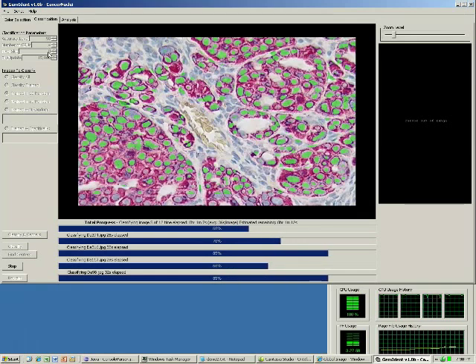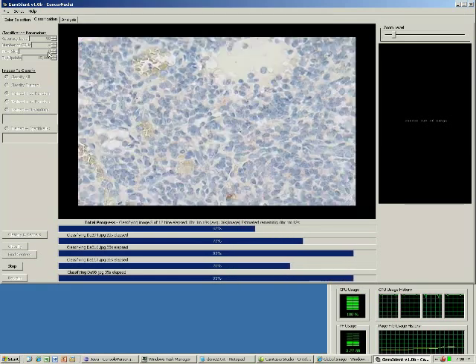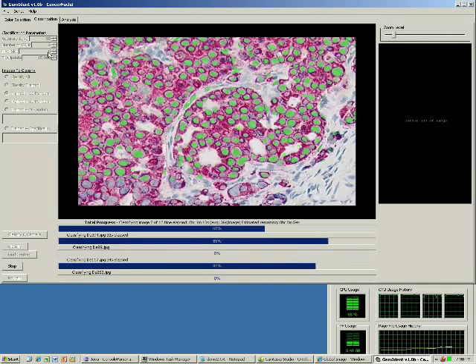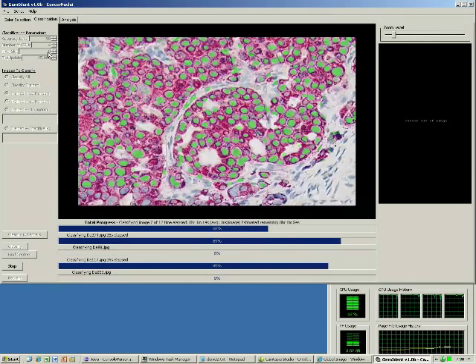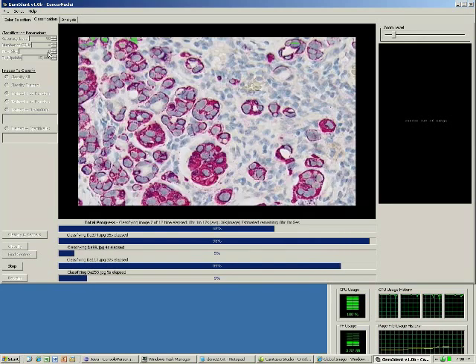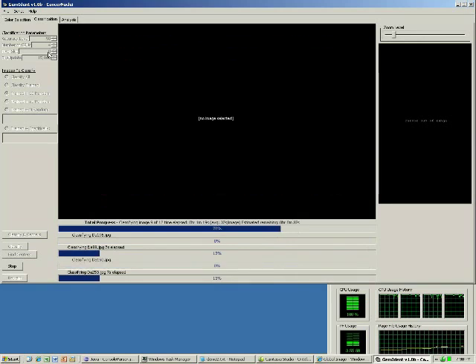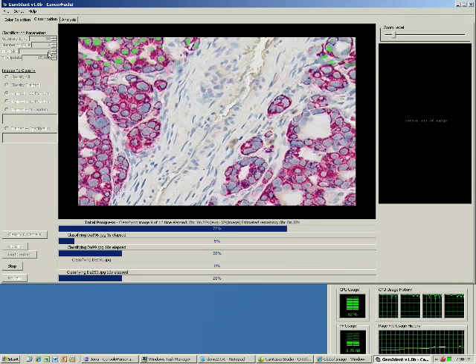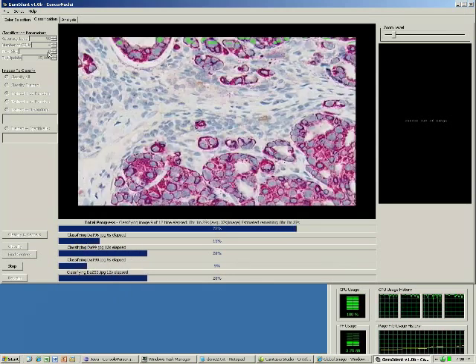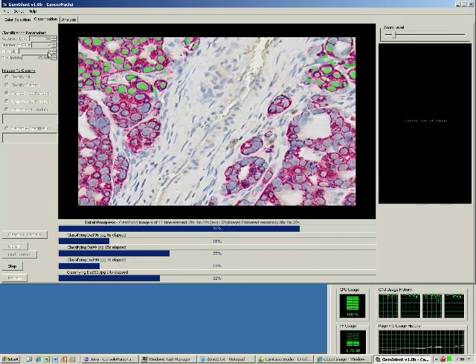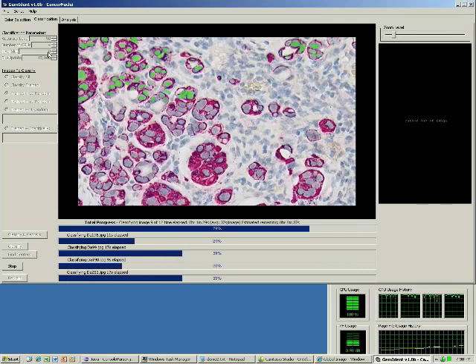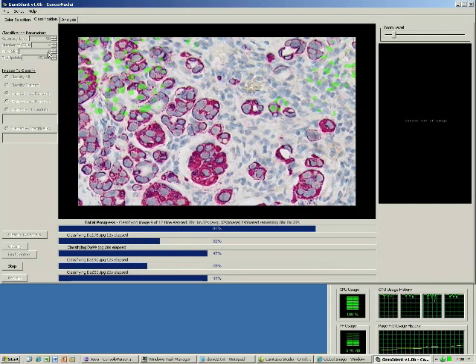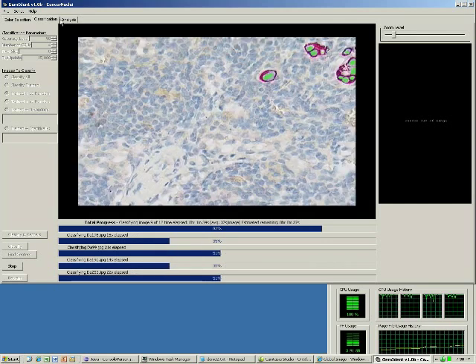The pixel skip, which is here, which is also zero, tells gemident to classify every single pixel, not skipping any. If the phenotypes are large, you may get an accurate analysis by skipping every other pixel, pixel skip of one, or every two pixels, pixel skip of two. This depends on your application. All this information is in the easily accessible manual.